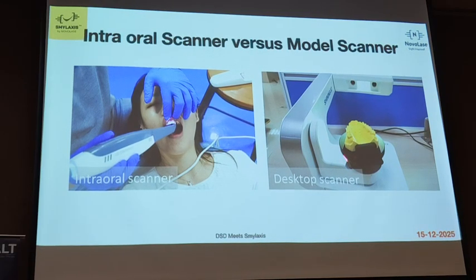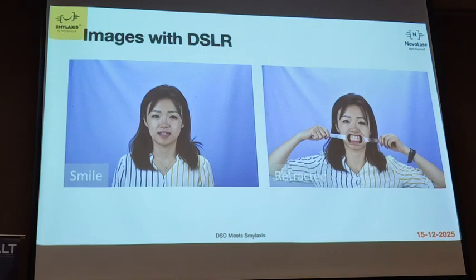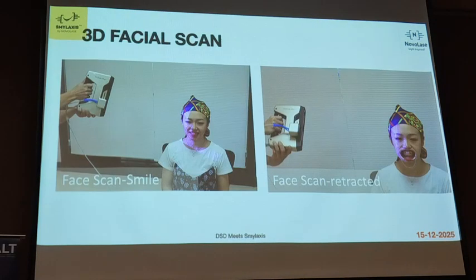This will have more errors because this will carry the same error that was duplicated in making an impression. Got it? So the intraoral scanner will be ideal for us. If you have the option of getting the scan done, that is ideal. And these pictures, as I told you, different smiling, exaggerated smile.